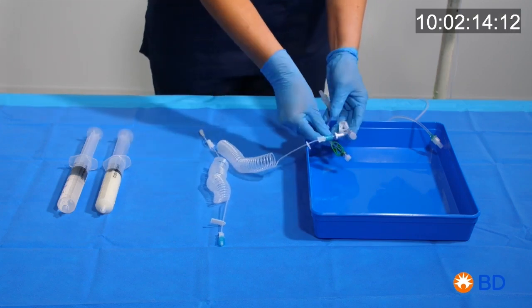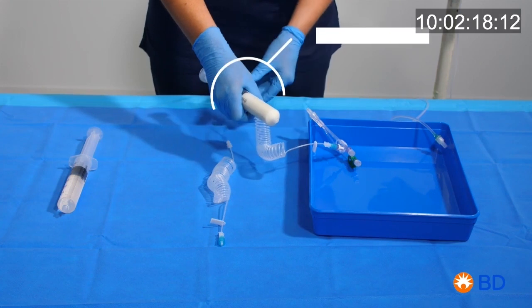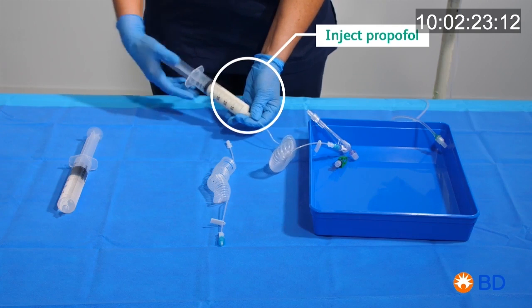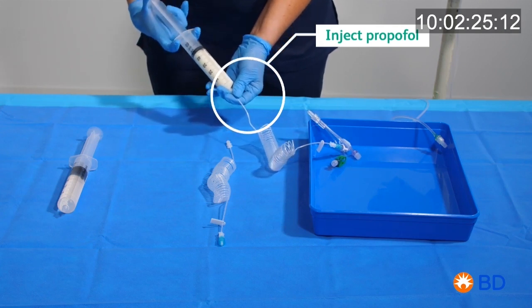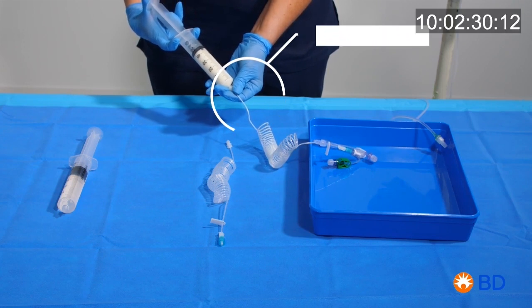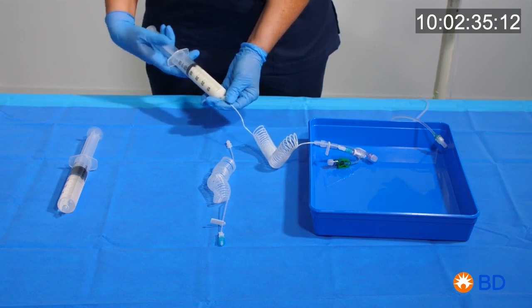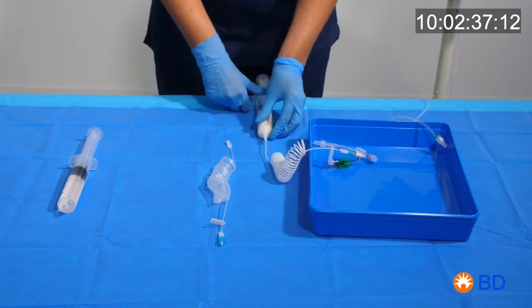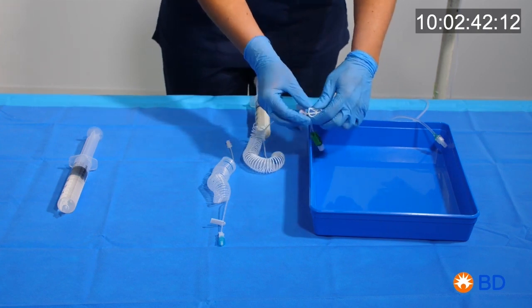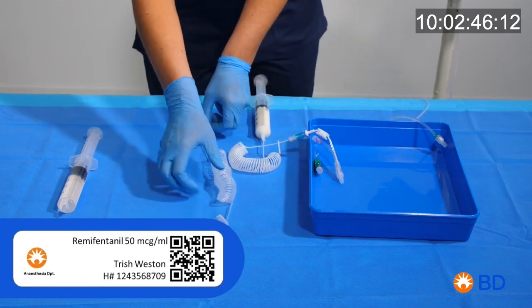Prime the line with the white connector with propofol and close the white clamp. Prime the line with the green connector with remifentanil and close the green clamp.